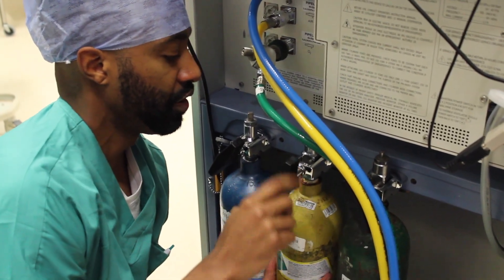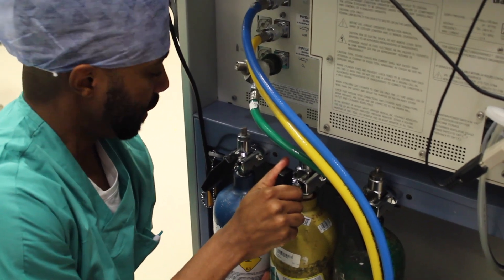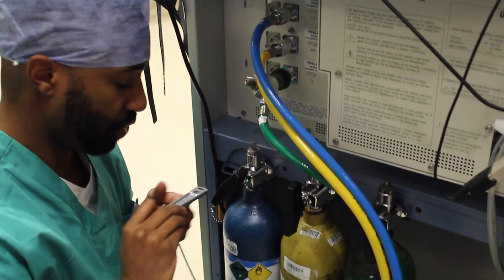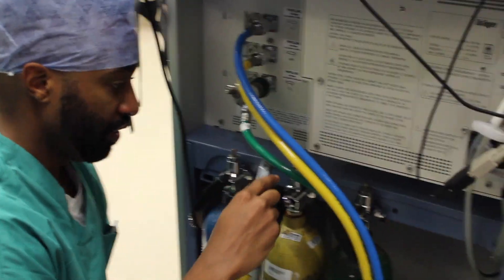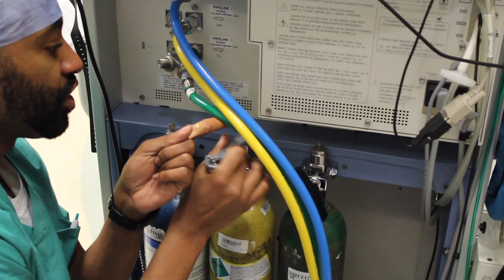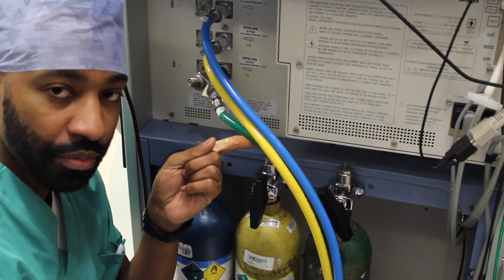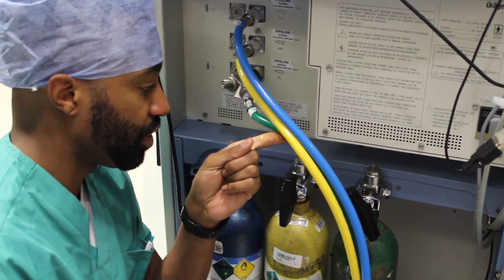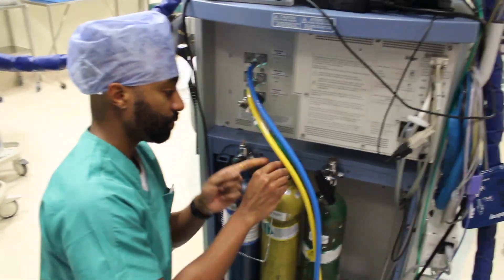Twist and close. It should hold, and the way to confirm that you're sealed — that you're locked in and there's no leak — take your key for your cylinder and open. You should not hear any hissing beyond that. And that is how you change the new tank for the back of the anesthesia machine.